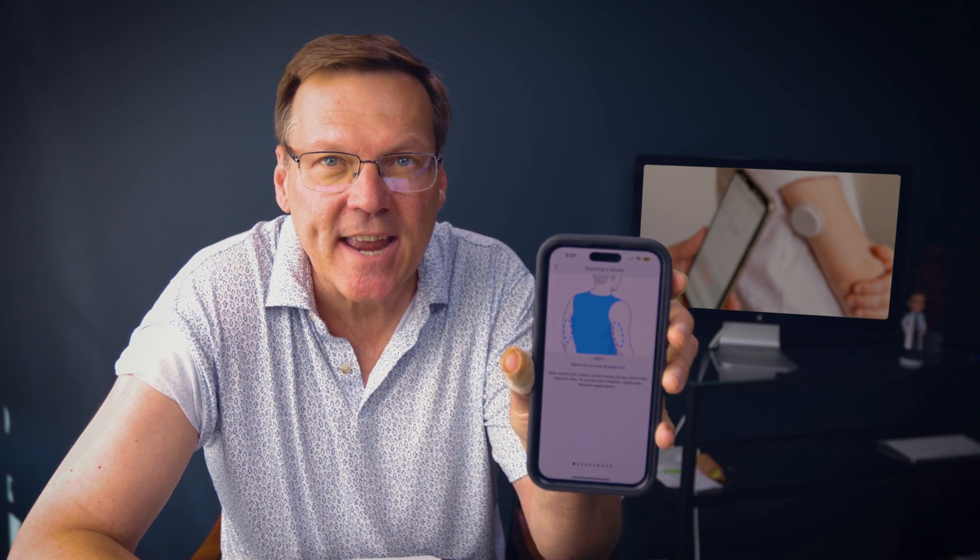The app walks you through each step: Step one, select the site — I've already done that on my arm. Step two, it shows where you put it. Step three, it shows how to open and take the top off. Step four, it shows how to line up the arrows. Step five, this is lining up the arrows, then pushing it down. And now we have the applicator with the needle — you saw me press it into my arm. There's my sensor — we're ready to go.